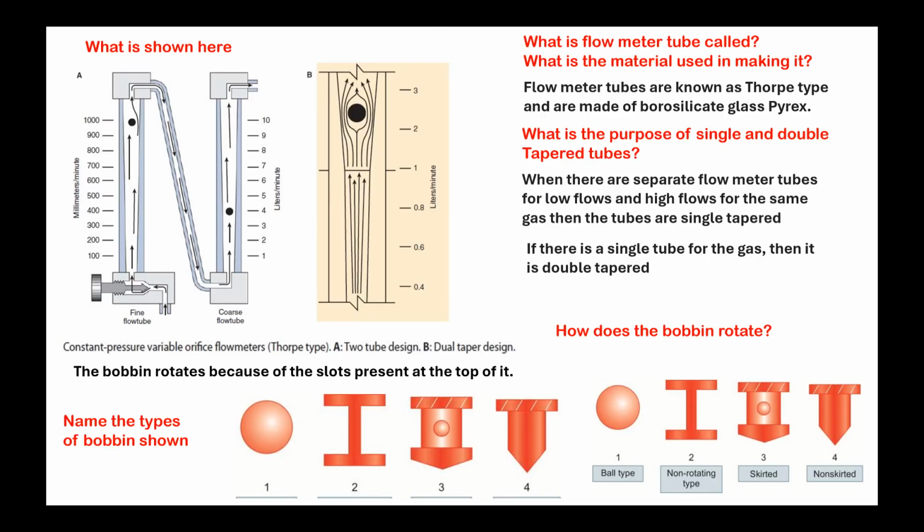In which condition, even though the gas is flowing, the bobbin may not rotate? This is one of the common questions they ask you in the exam.